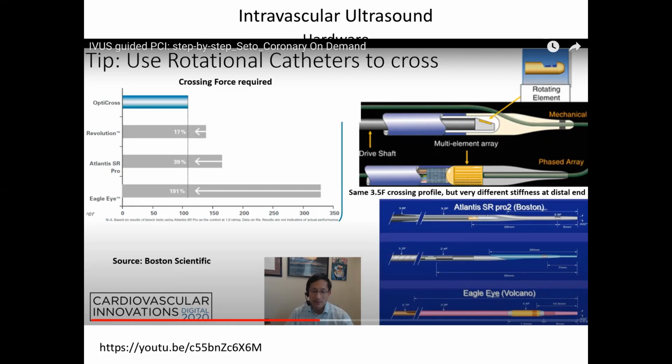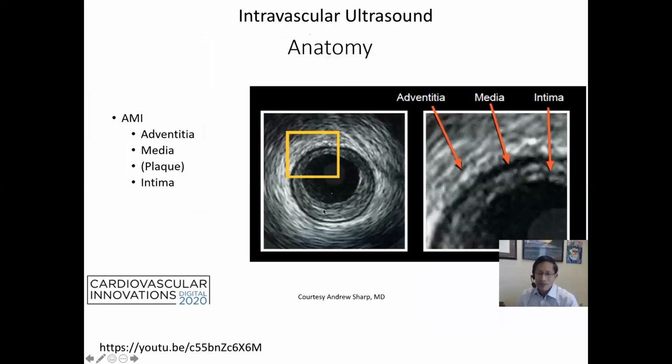This has been a field of investigation for many, many years. Like Paul Yock, who's a guy at Stanford, started a company 35 years ago on this, I think, something like that. So it's a fairly mature technology at this point. However, it's expensive to pull one of these down and take an image with it, and then you throw it away, right? And so you really have to ask yourself, do I really need that much information about this lesion, right?